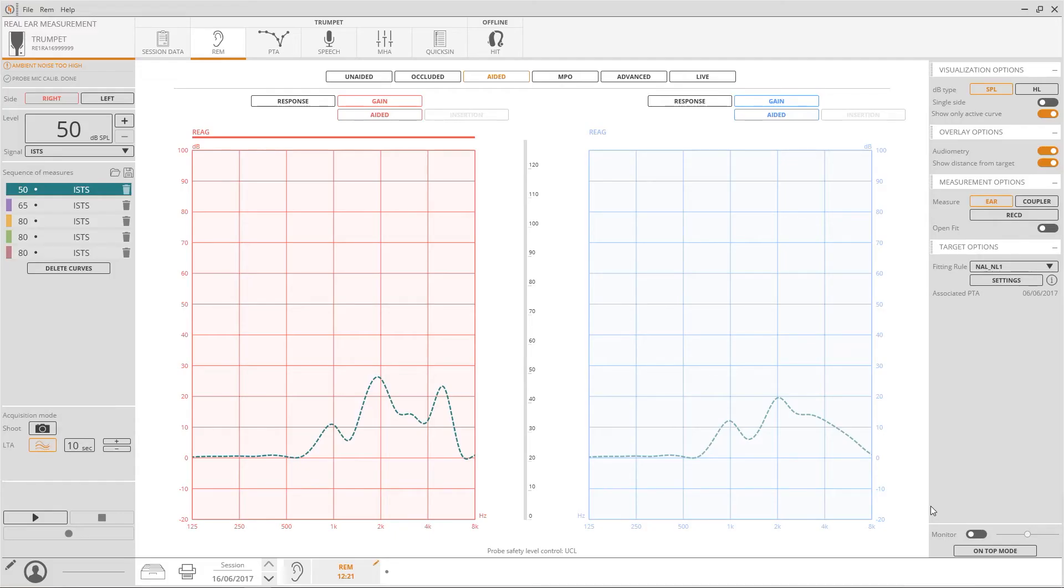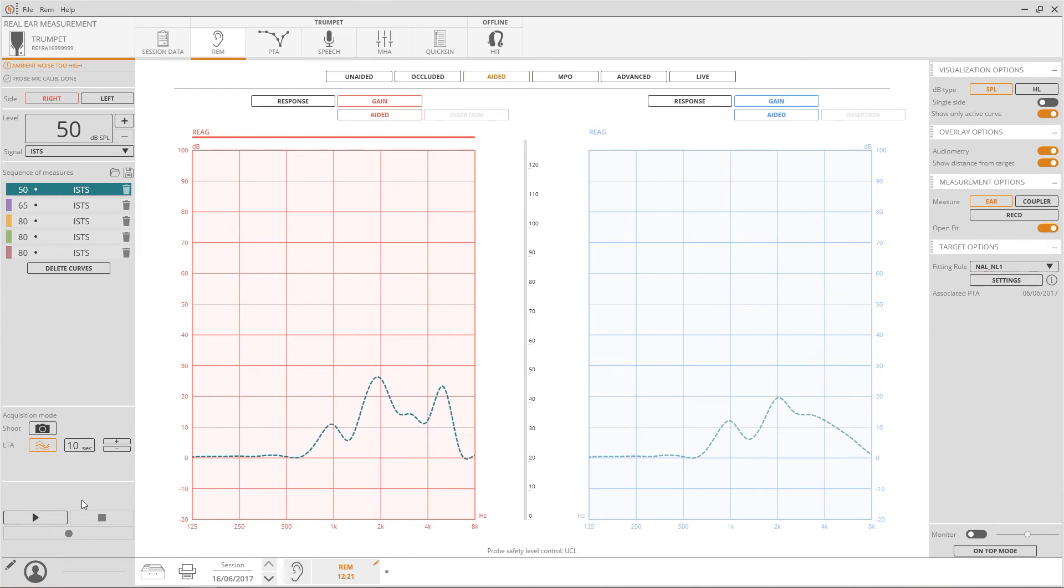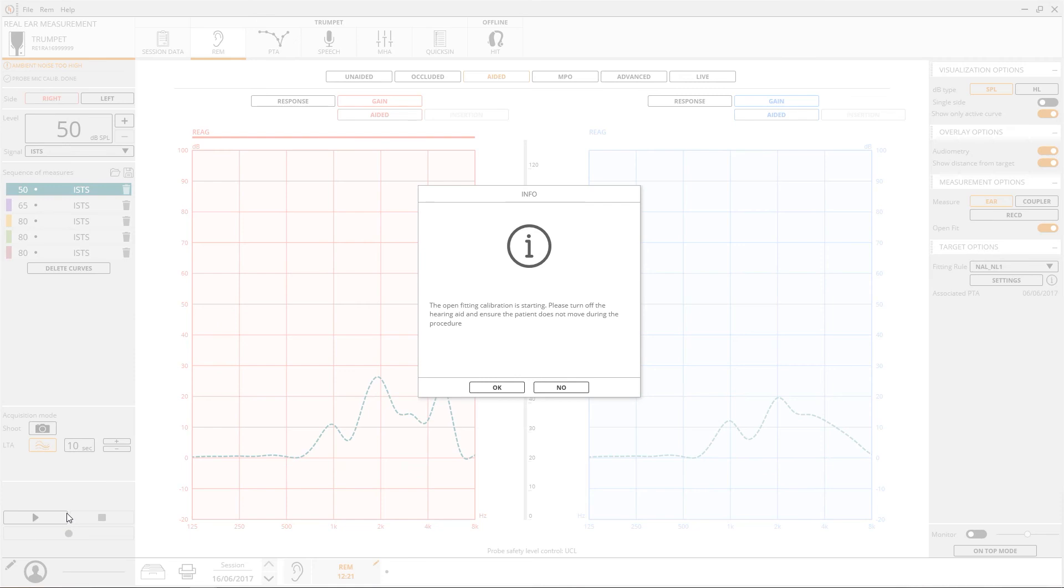Please be aware that if you have a hearing aid with an open dome, you should first select the open fit option. The system will then ask to perform an extra measurement with the hearing aid turned off in order to avoid a feedback loop.